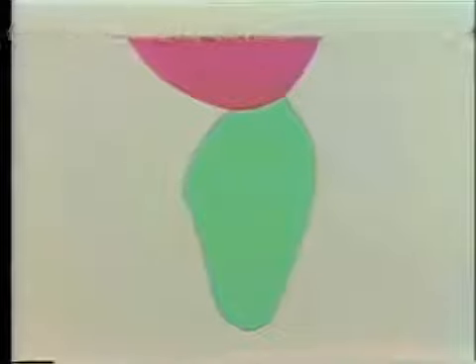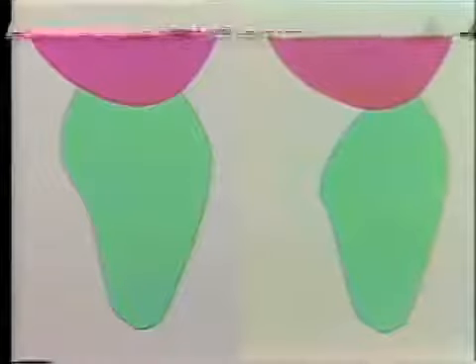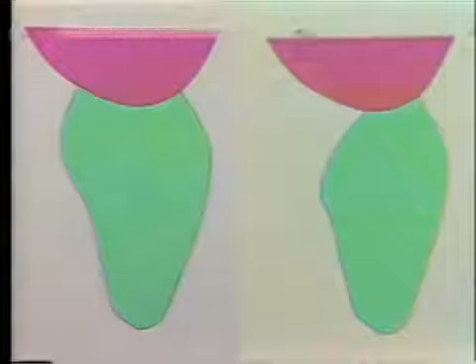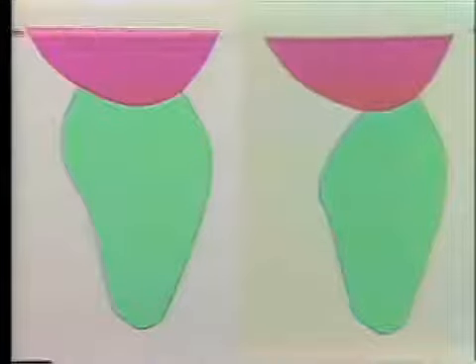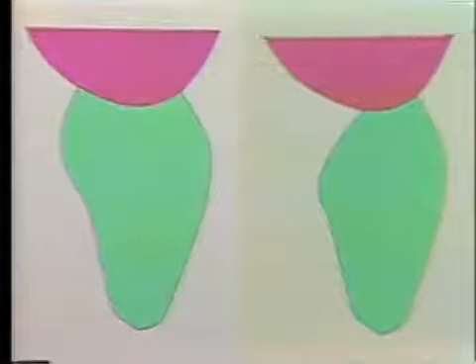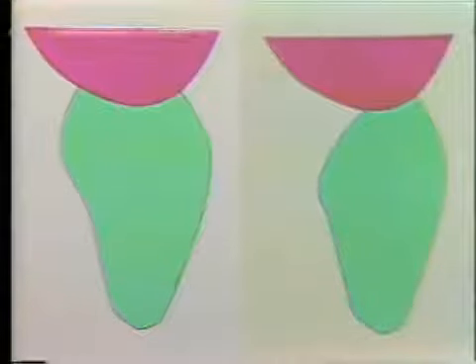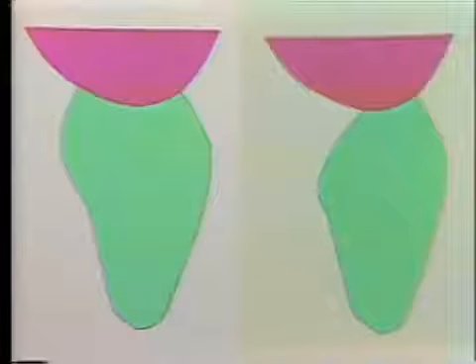There is another type of Pontic which is used in the anterior situations and sometimes in the posterior, described as the saddle Pontic. And I think you can see how the name is derived from the relationship of that Pontic to the alveolar ridge. It sort of sits across it, much in the way that the saddle does on a horse's back. And the area of mucosa which is covered is considerably greater, nor is it so easily cleansed under there as is the ridge lap type of Pontic.